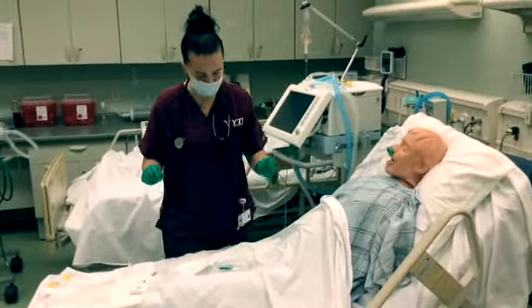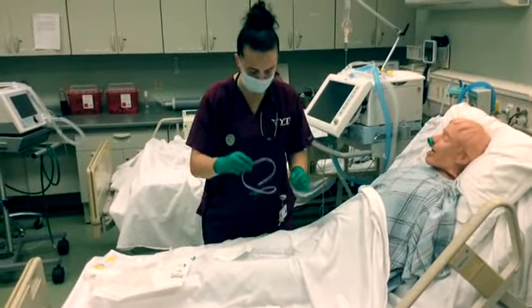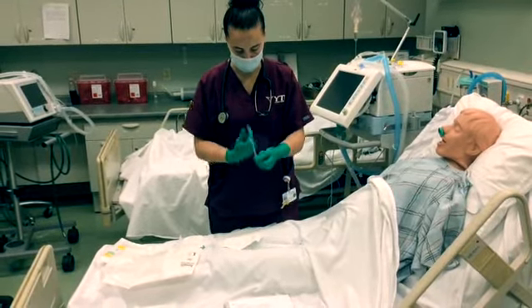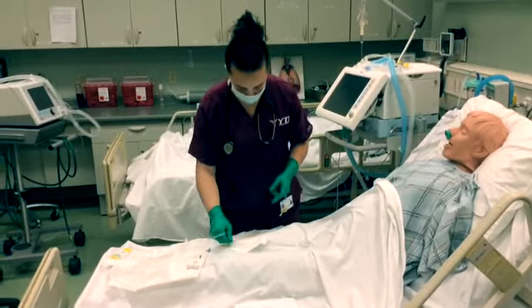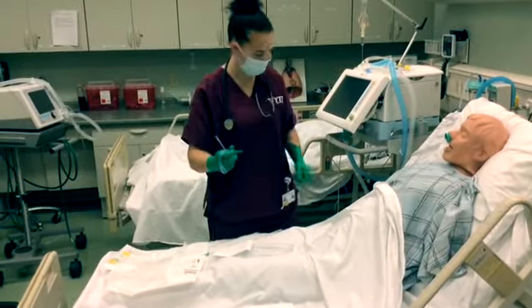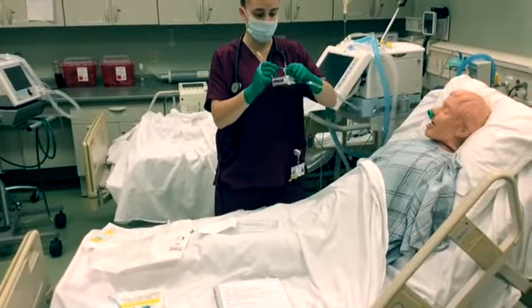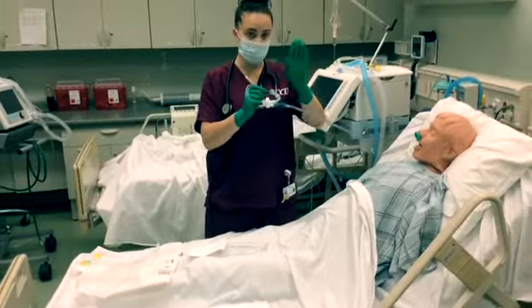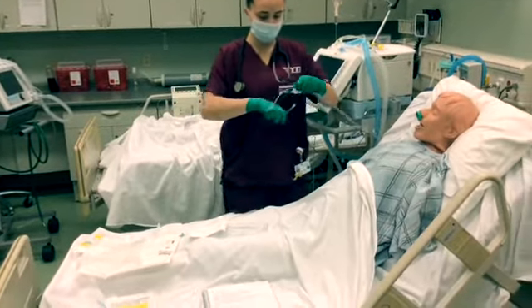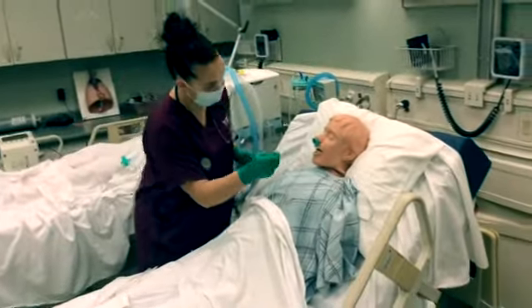Now that your hands are sterile, you want to use your dominant hand. And to use your lubrication. And to get a sputum specimen, you're going to hook. Now since this hand touched, this hand is now dirty. You keep that hand away from your patient. I'm going to insert.